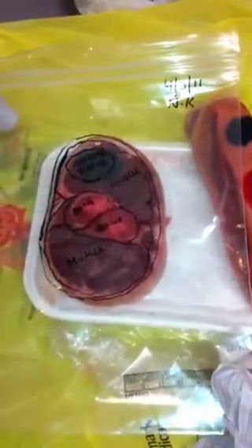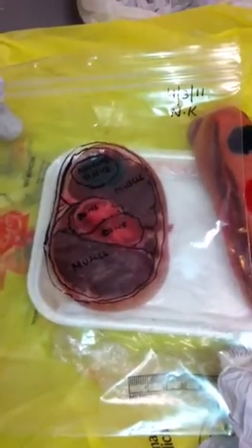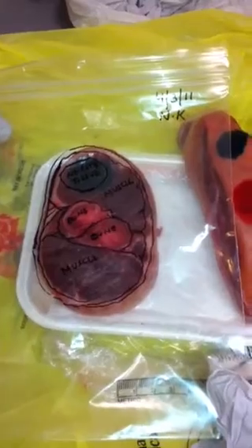I traced the baggie on the ham hock and as you can see, we have the necrotic tissue defined here. We have the bone, the muscle, and then this shows the connective tissue.